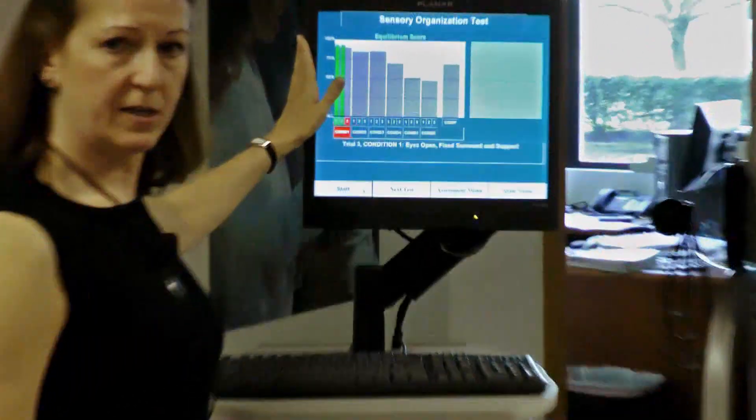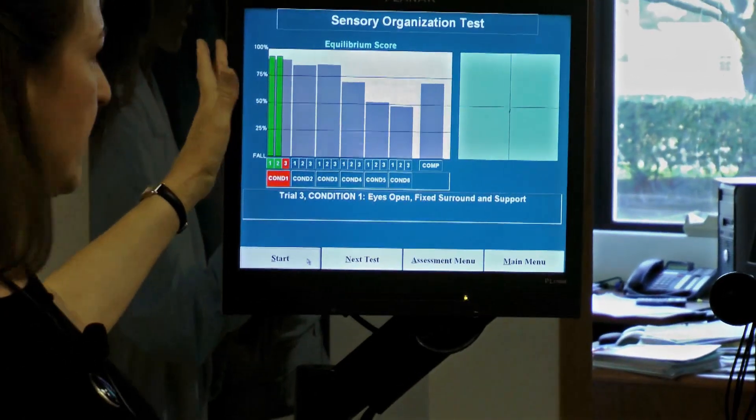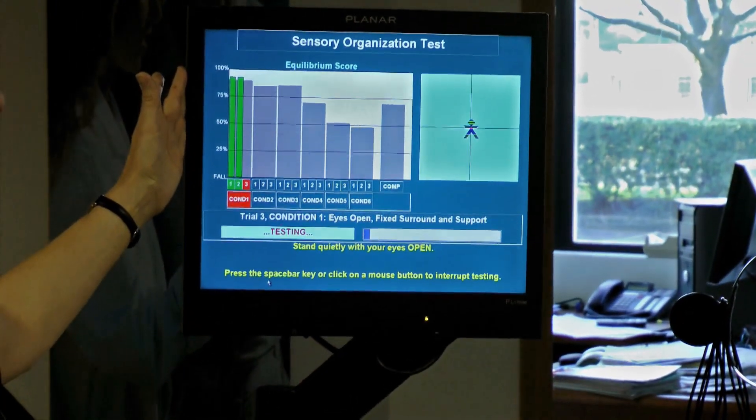I get feedback right away, but the client cannot see that.